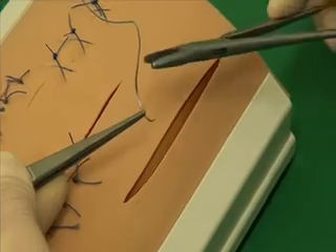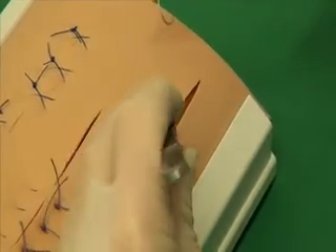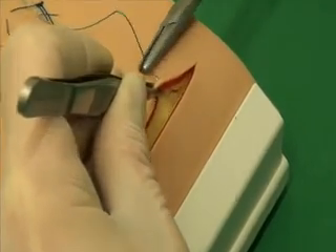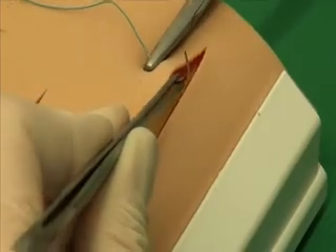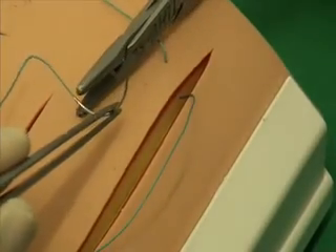In this suture pattern, the material runs in a U shape. Using forceps, raise the wound edge. The needle should be held perpendicular to the wound. The needle is positioned and then passed through the subcutaneous tissue, which is shown in yellow, and out of the wound. The suture is continued on the other side of the wound.